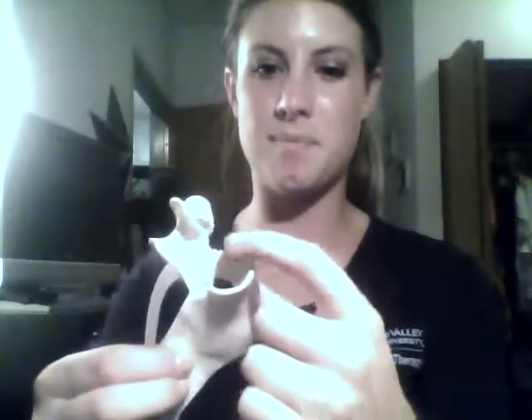There are three different parts that went into the splint. The first is this one around the thumb that goes into the palm and over the top of the hand. The second part is the index finger support, and the third part is the pen support — this little loop here.